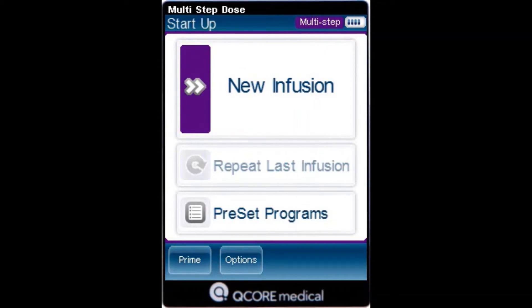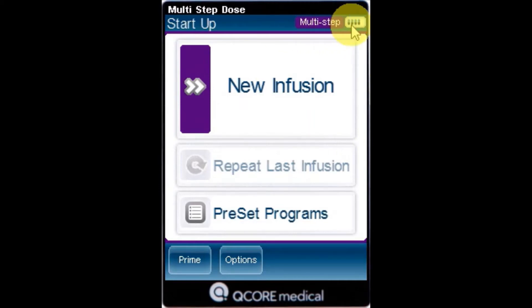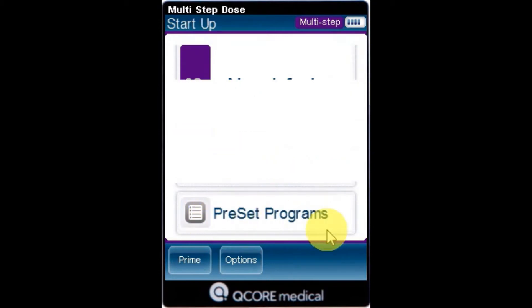To edit a preset program, on the indicator bar, verify that the pump is in the desired delivery mode, and from the startup screen, select Preset Programs.